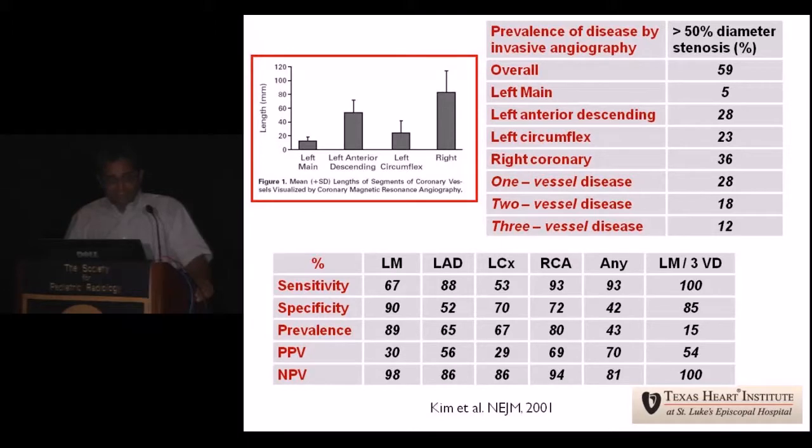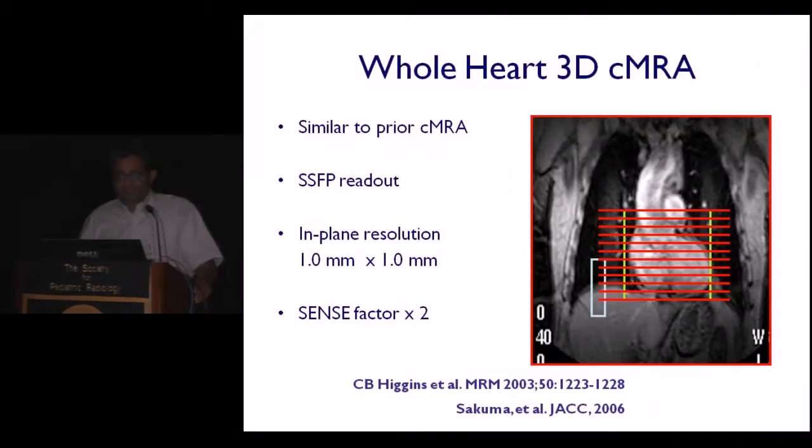So in summary, navigators extend the acquisition time beyond breath holding capacity. So we have taken care of the spatial resolution part. How about contrast? What we do is a couple of things. One is the epicardial fat. We apply a fat suppression pulse to make the signal from the fat disappear. Now we need to generate contrast between the arterial blood and the cardiac muscle.